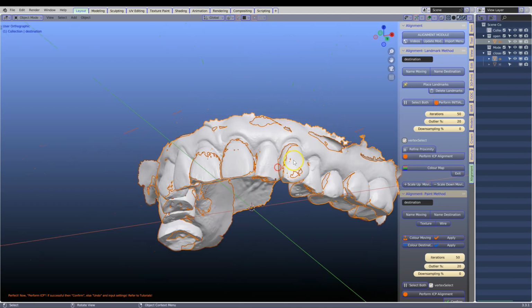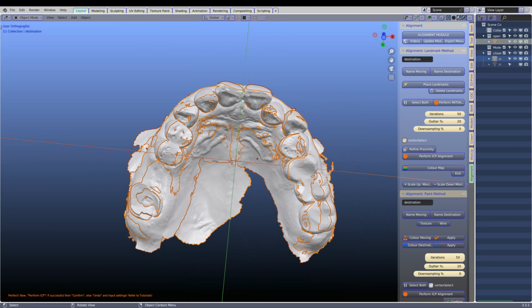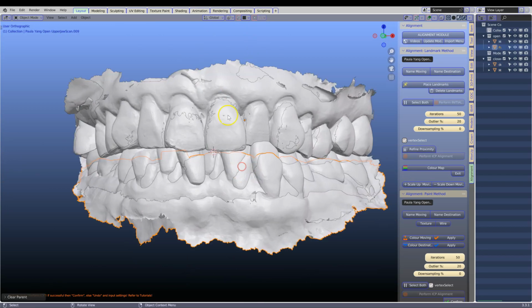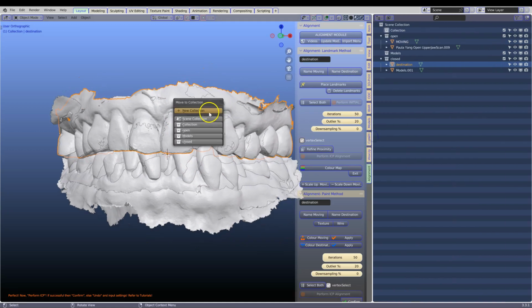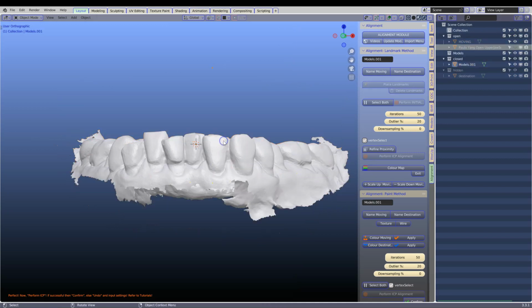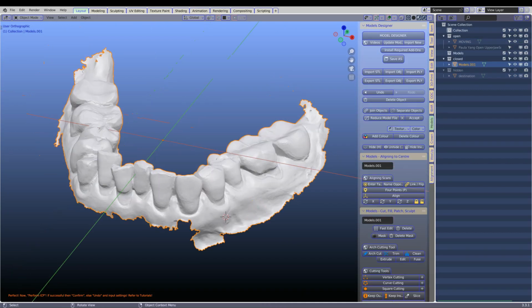Unfortunately, the scans are a little bit dissimilar, so they don't overlap 100%. Using Alt-P to clear the parent and keep the transformation. Then we're going to do a bit of object management, and one of the uppers I'm going to hide because we only need one upper.